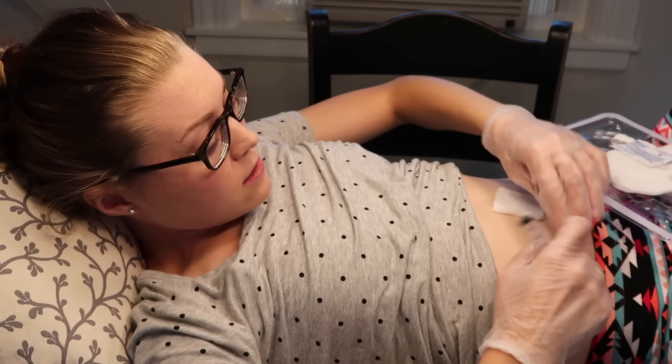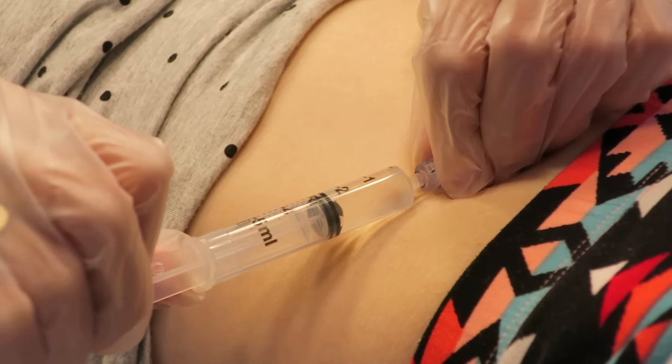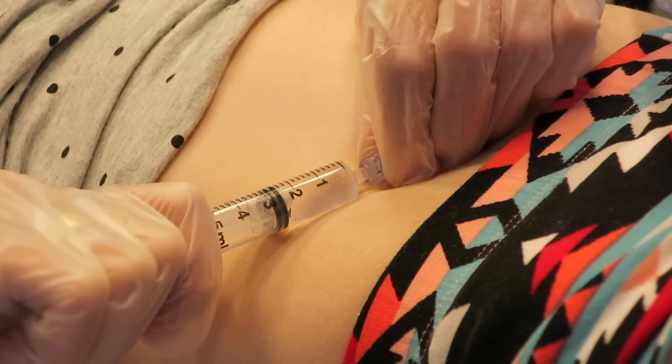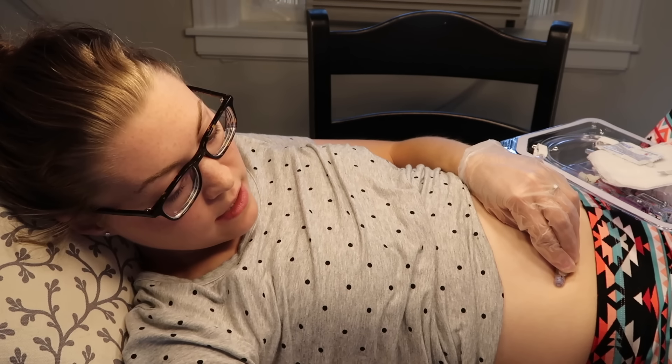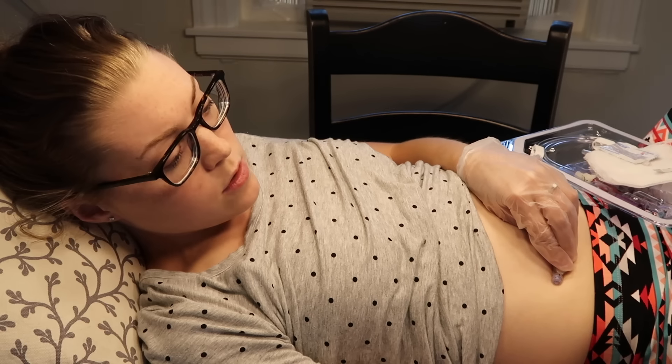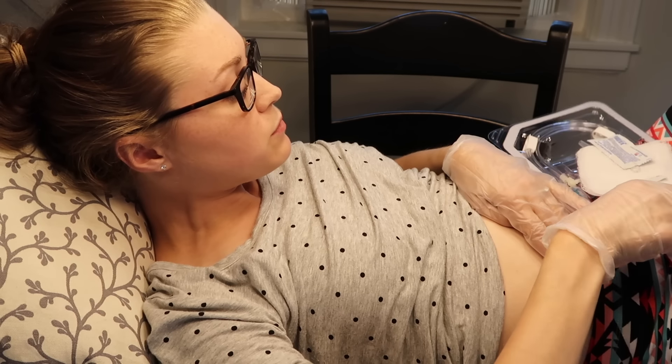So the first step is to take the water out of my previous balloon. When she puts the syringe on, the water just basically pushes right out. I've been doing two and a half mLs of water and that's what I got out. Now it's basically just the deflated feeding tube stuck in her. I'm going to fill my syringe up so that it's ready — I emptied out the old water. Warning: the inside of my feeding tube is going to be brown because of the acidity, like the stomach acid, even though it's in my jejunum — my jejunal juices. If you don't want to see brown, then don't look.